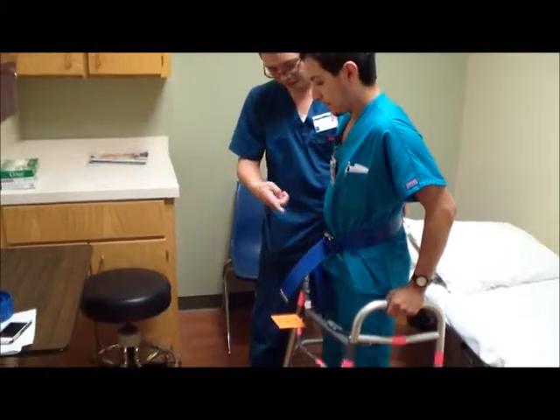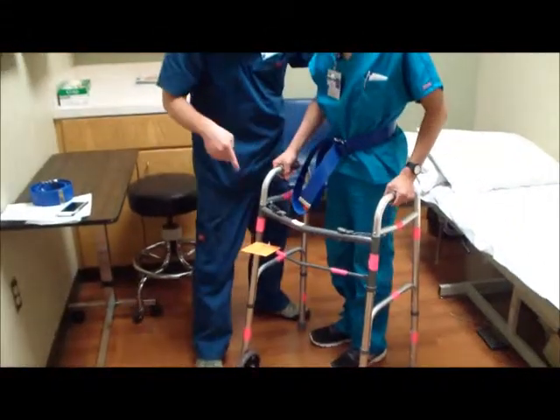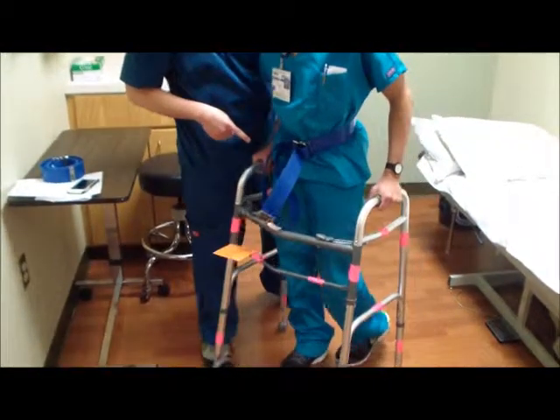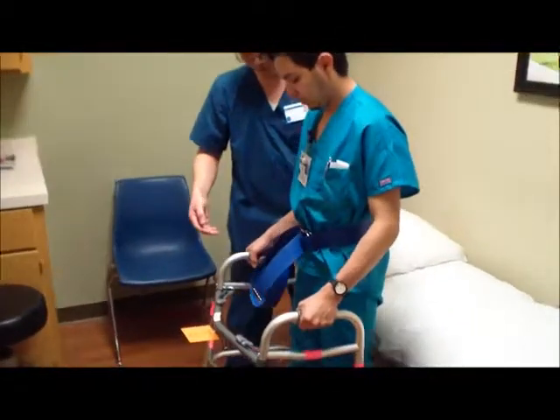Okay, and so we're going to turn again to the left. And then step with your right leg, again pushing down on the walker, and then shift your weight. Now go ahead and back up a little bit more.